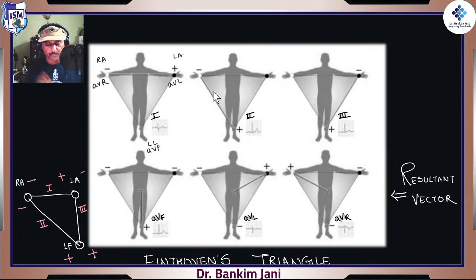F, foot. So AVR, AVL, and AVF, right? One more thing, put it like plus, plus here, plus, plus. This means this AVF will always be plus, true? So coming up with the first part, this is what we are dealing with. Here it is.